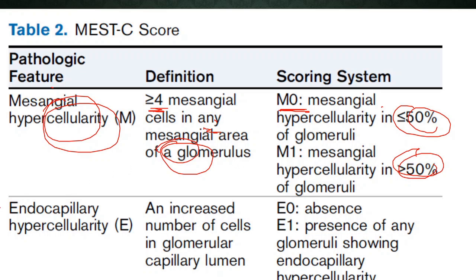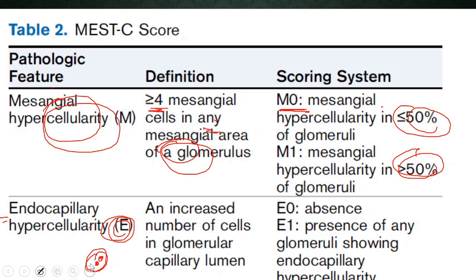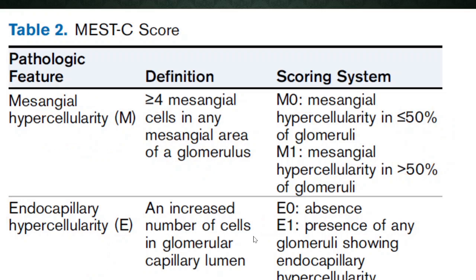The next parameter is endocapillary hypercellularity — it is the increase in the number of cells inside the lumen. Any inflammatory cell inside the lumen constitutes endocapillary hypercellularity. A score of E0 is given if it is absent, and E1 if present.